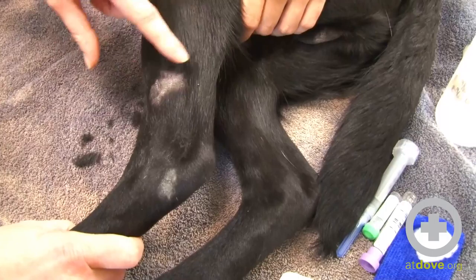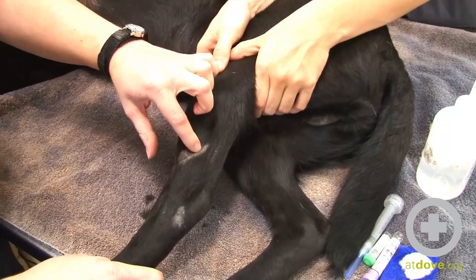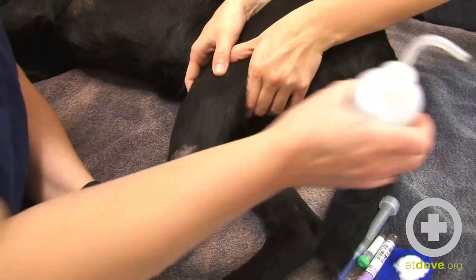It's going to run right over here. I can kind of push it with my finger, and I'll have Sarah hold off. So when you've got somebody occluding this vein, you kind of want to hold off behind the knee. Here's the stifle here. Sometimes it helps to wrap your whole hand around, but now you can see this vein popping up really nicely.